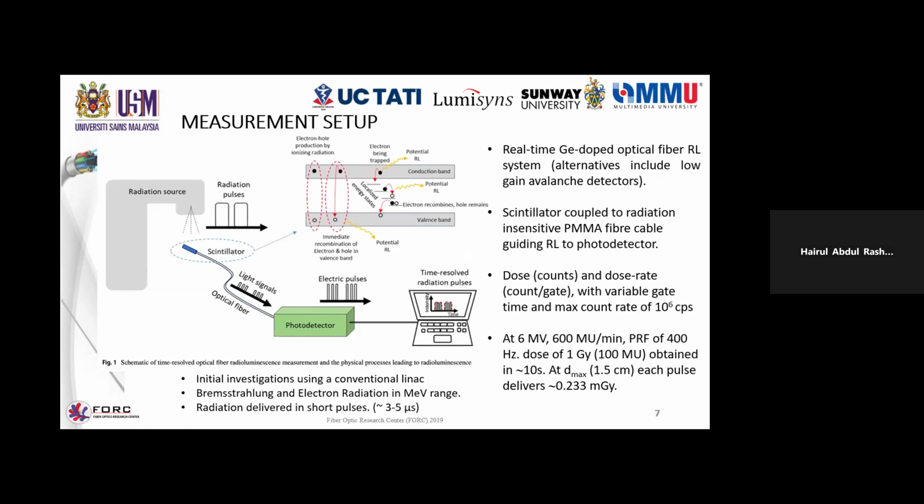Now, the method that we focus on is essentially radioluminescence. If you look at the diagram, a radiotherapy setup with radiation pulses being exposed to the scintillator or optical fiber. The optical fiber, through the mechanism of radioluminescence, produces light signals in correspondence to the exposure from the linac.